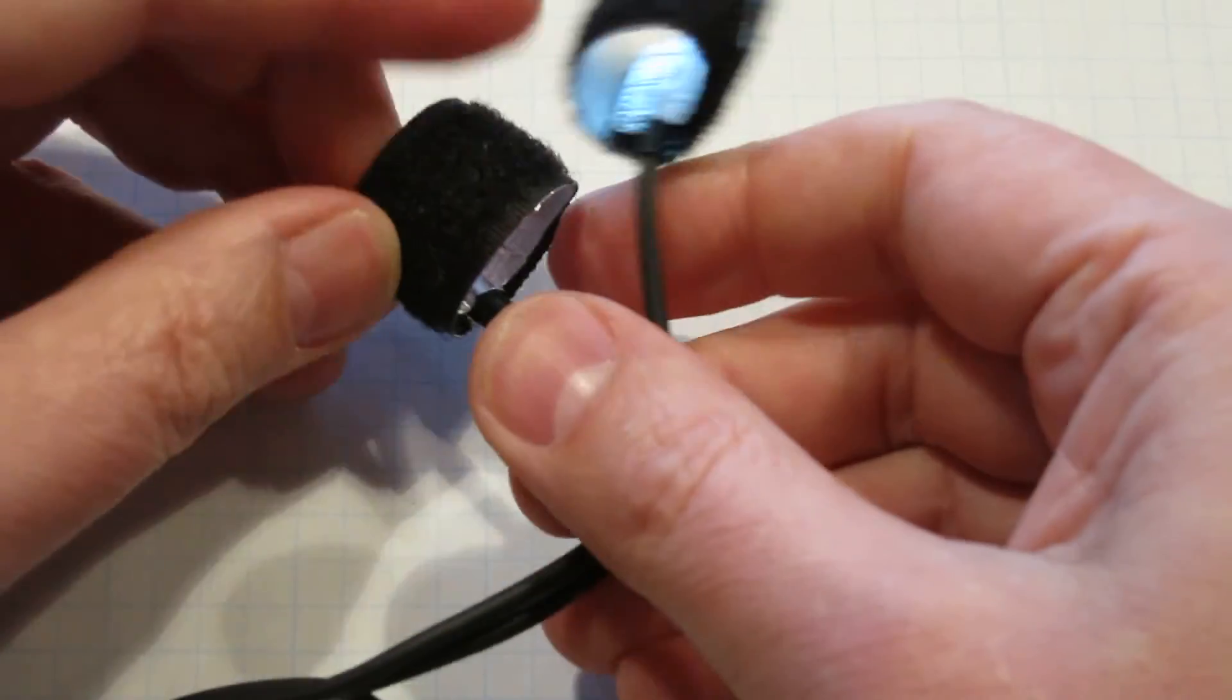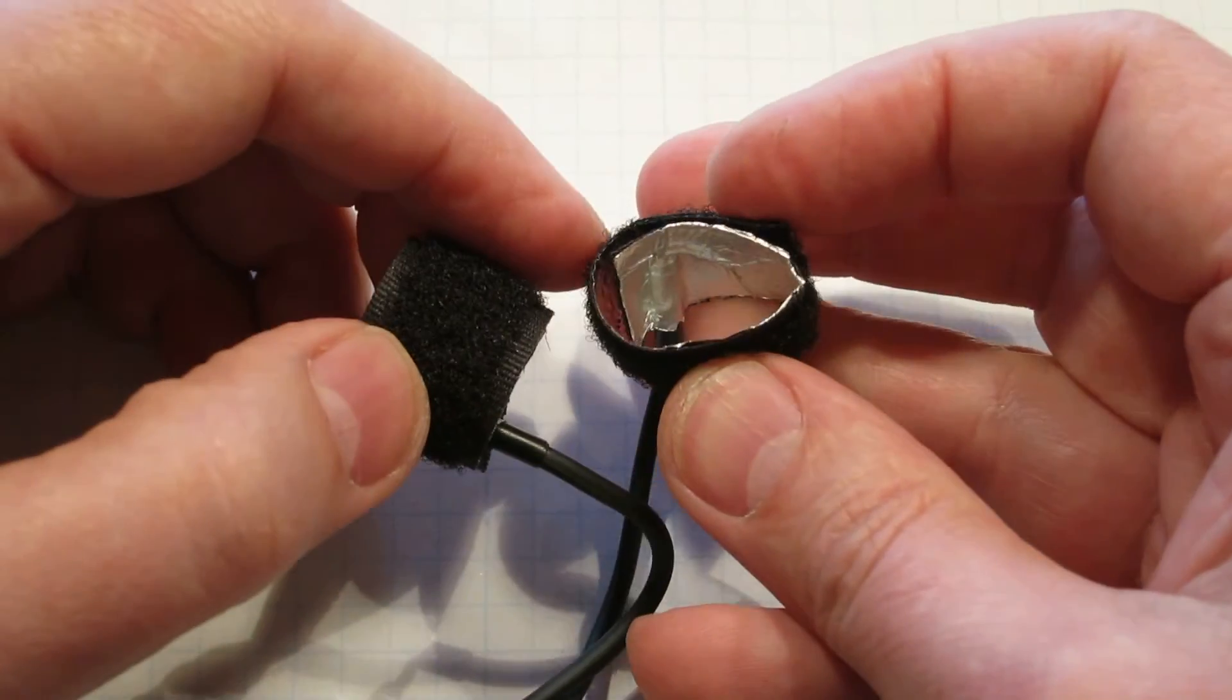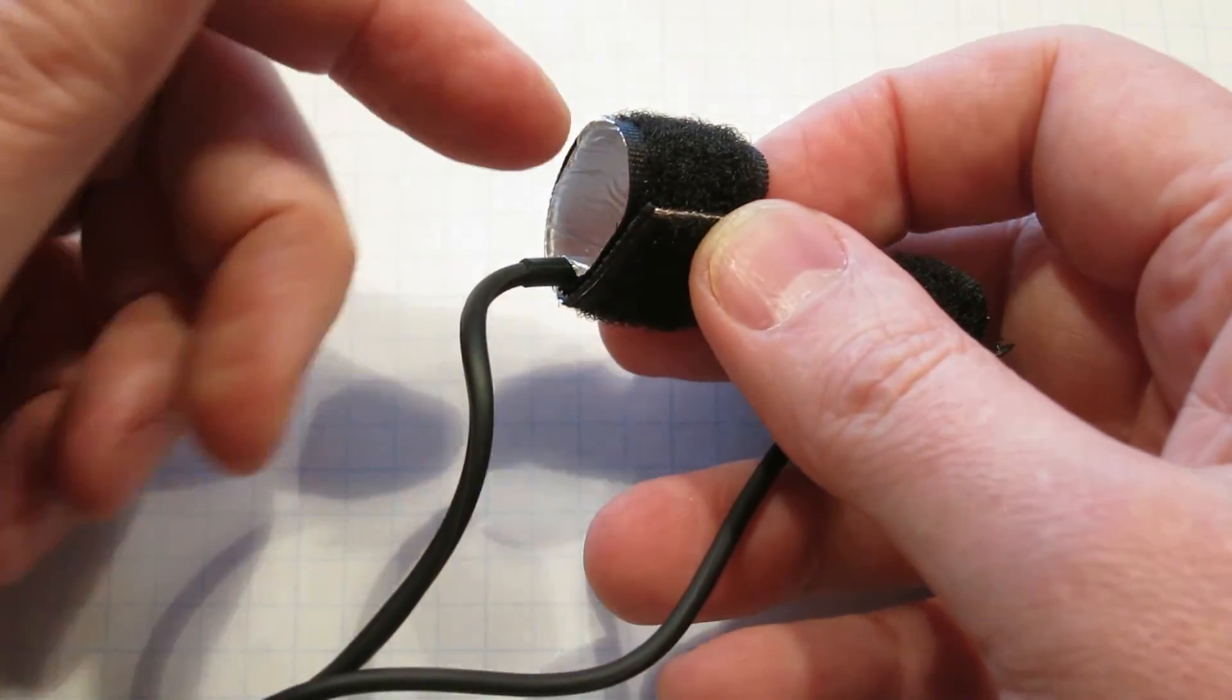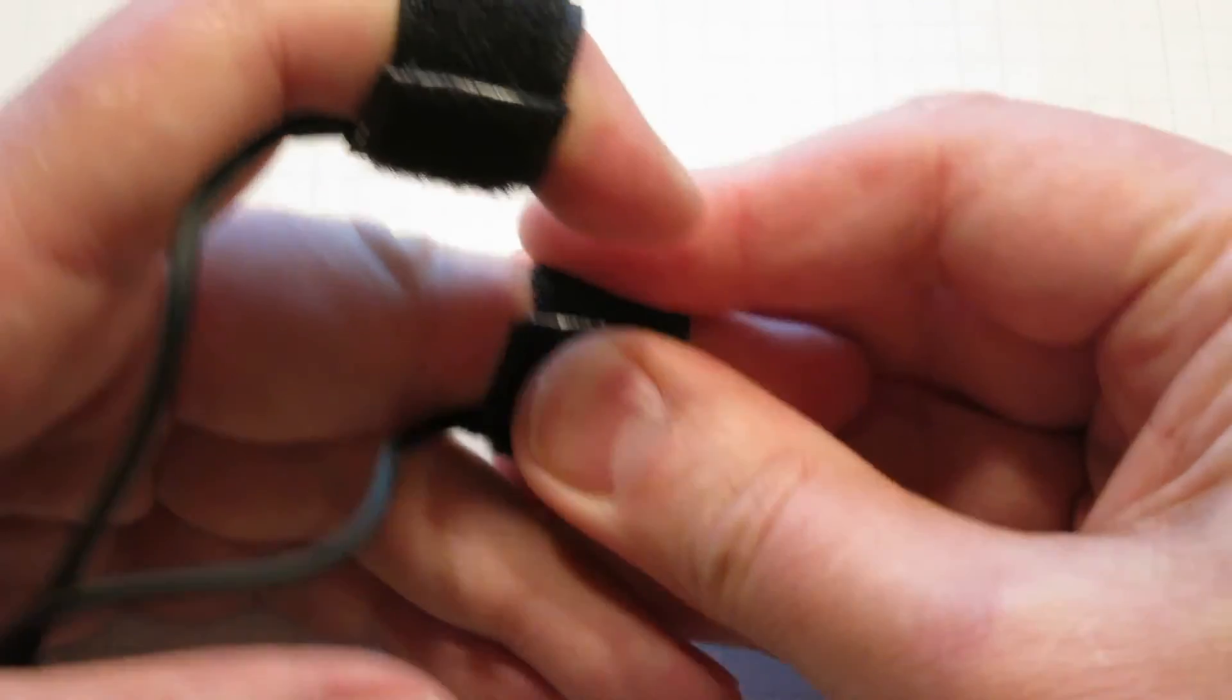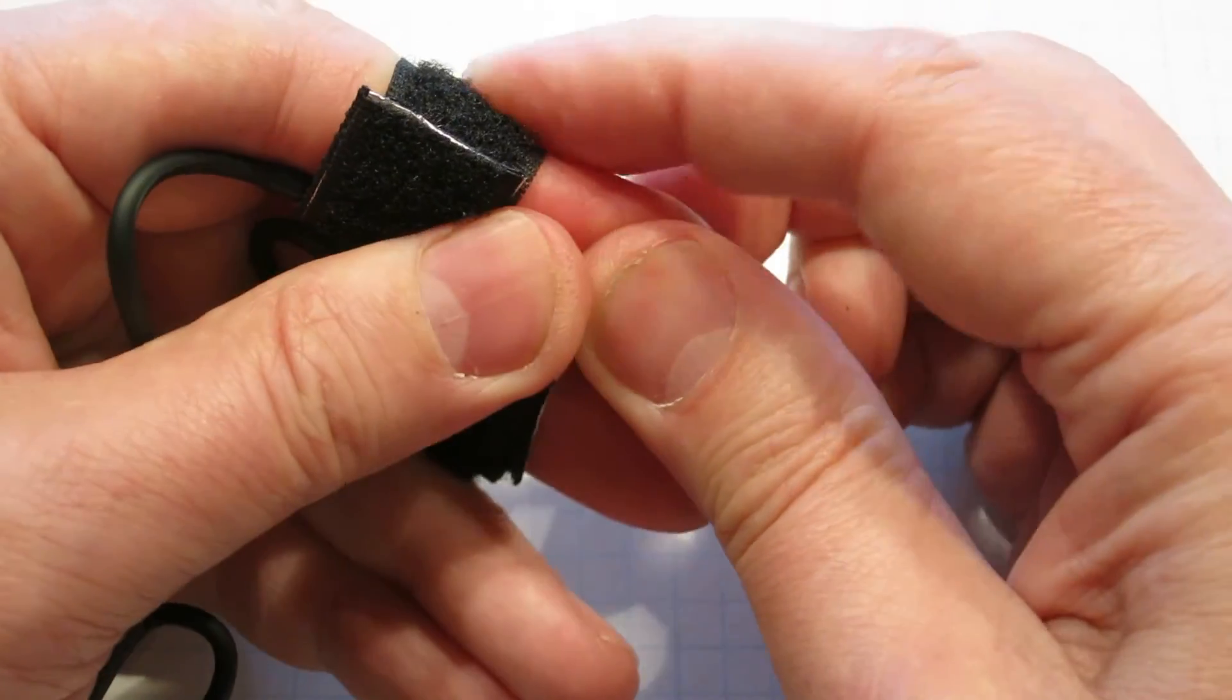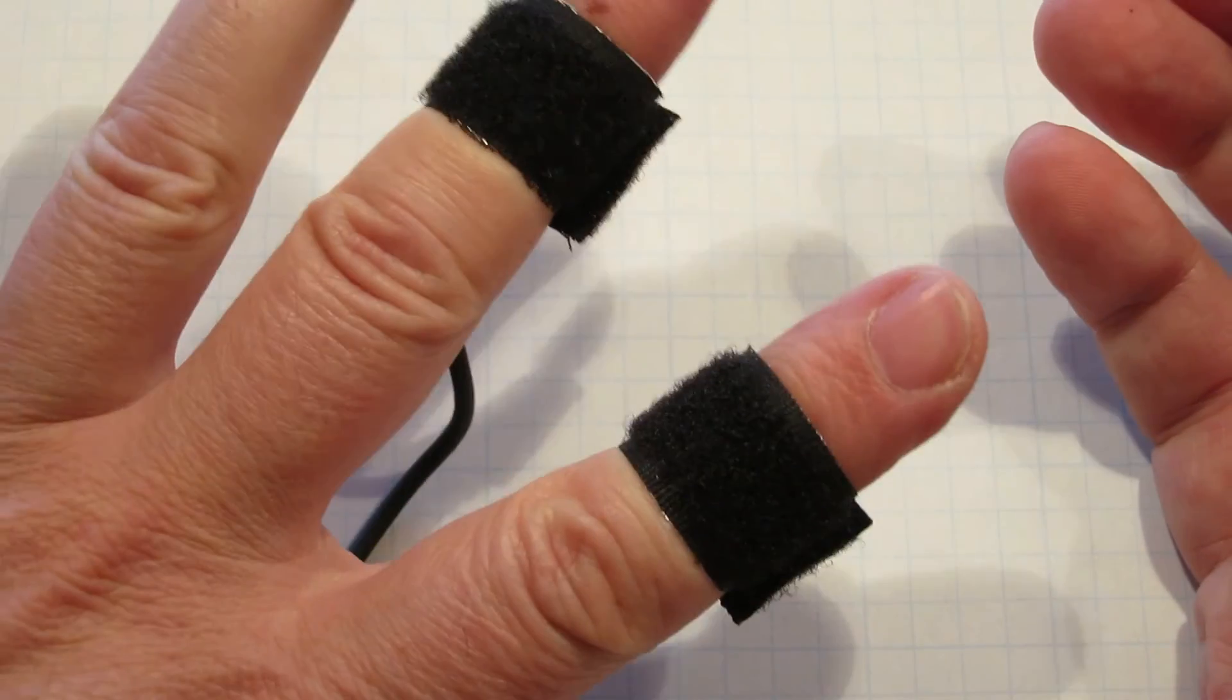The electrodes you loop to themselves with that Velcro, and you adjust them until they slide on your fingers so that they're tight, but not so tight that you're going to lose any circulation or anything like that. And there you go.